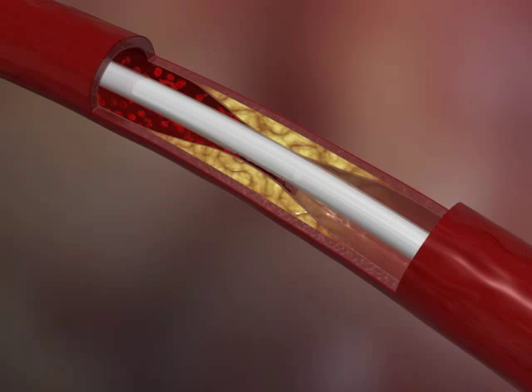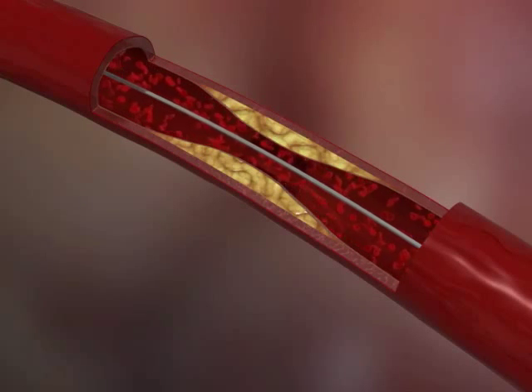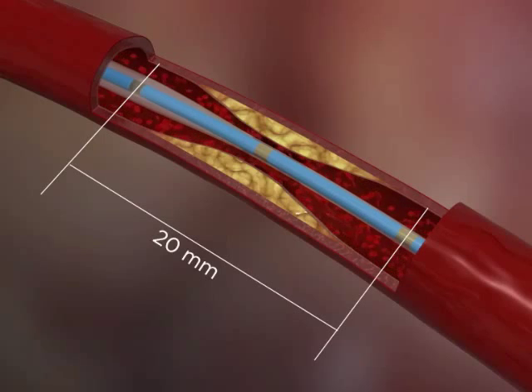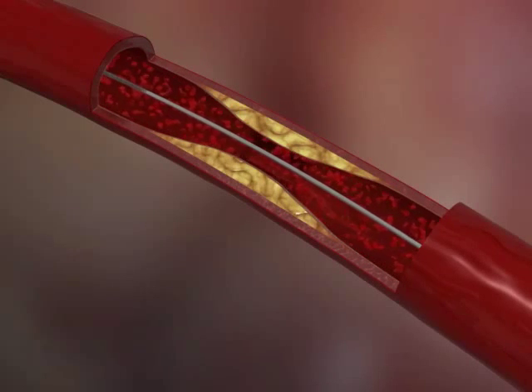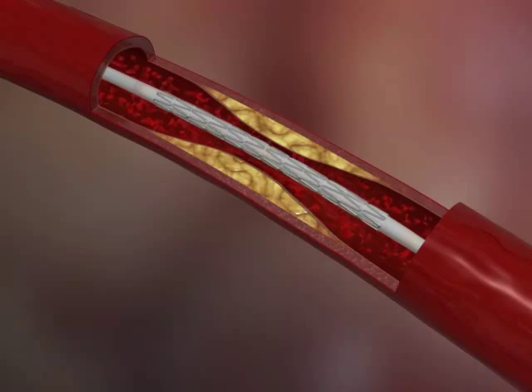When the Amicath is removed, the artery is rechanneled to TIMI 2 to 3 by means of the Dotter effect, enabling the characteristics of the lesion to be viewed and the need for aspiration to be determined. The size of the stent to be implanted can be determined thanks to the catheter's radiopaque markers and viewing of the vessel. The preparation of the artery with the Amicath allows direct stenting to be performed without predilation with a balloon catheter and the risk of distal embolism.